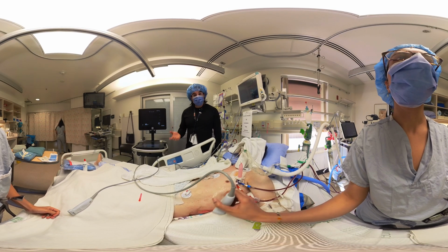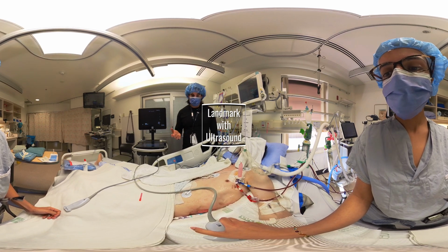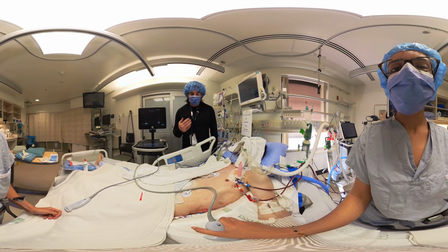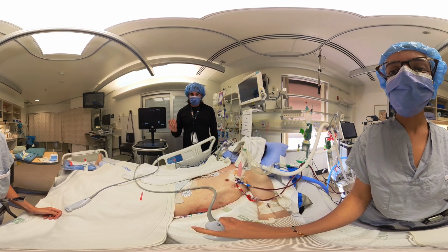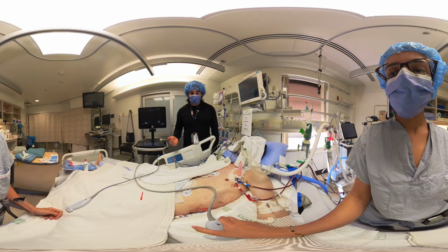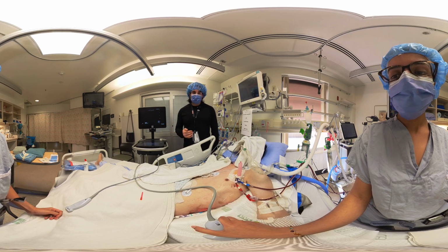Okay, so first we're going to landmark the area, and to landmark the area we image first. We're going to use a curvilinear probe. It's got a really nice depth and will offer us pretty good resolution in the lower thorax. So we're going to apply the curvilinear probe first to landmark our area to make sure it's the appropriate entry site for thoracentesis or a subsequent chest tube.